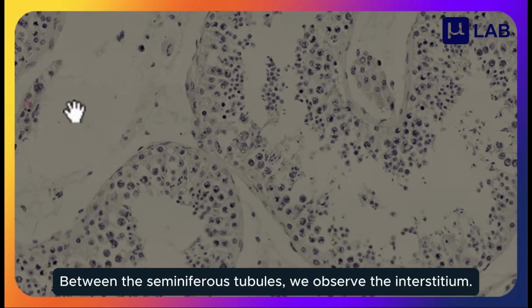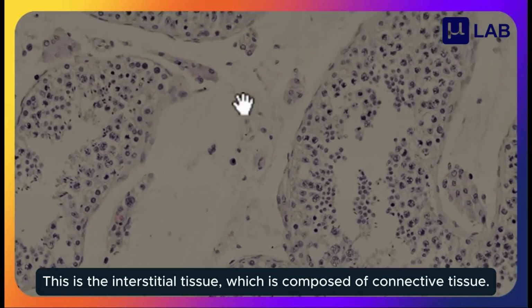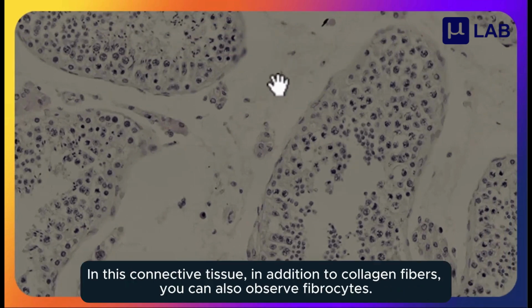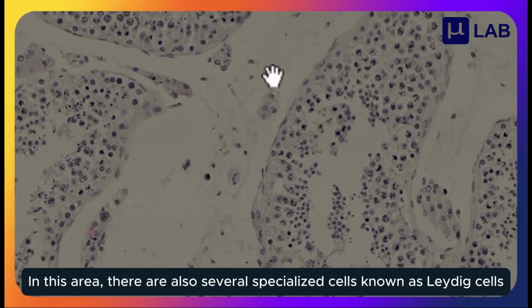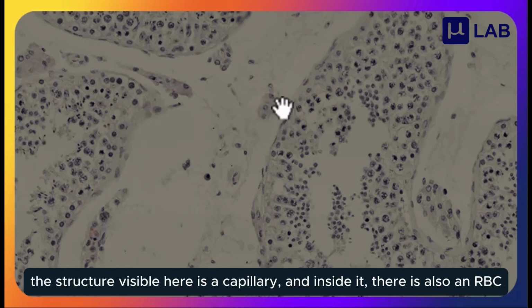Between the seminiferous tubules, we observe the interstitium. This is the interstitial tissue, which is composed of connective tissue. In this connective tissue, in addition to collagen fibers, you can also observe fibrocytes. In this area, there are also several specialized cells known as Leydig cells. Here, you can currently see 3 Leydig cells next to a capillary. The structure visible here is a capillary, and inside it, there is also an RBC.